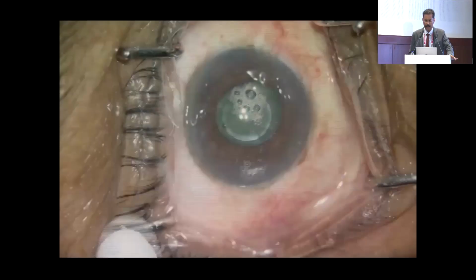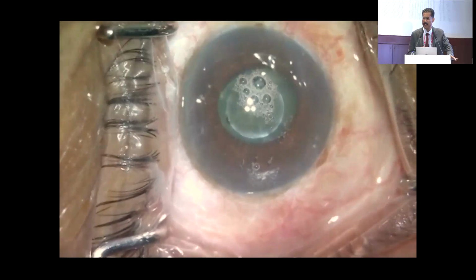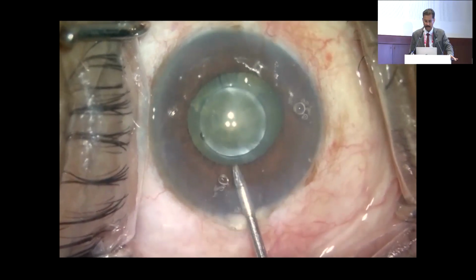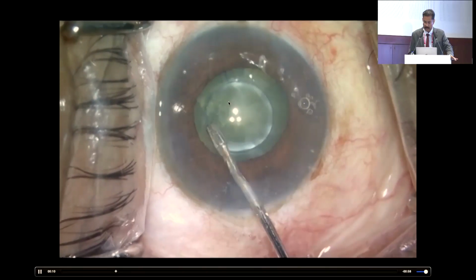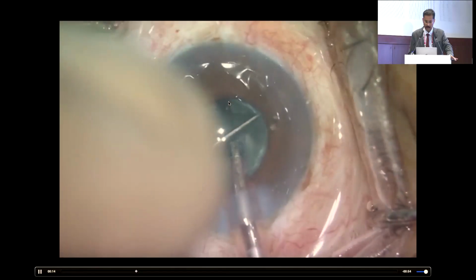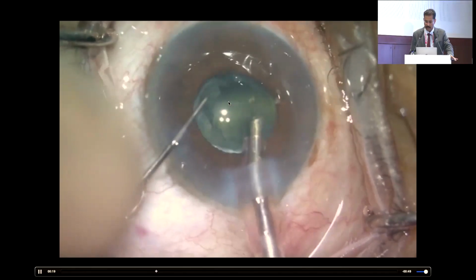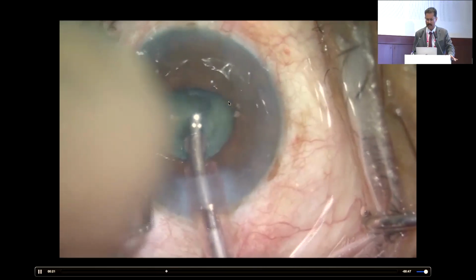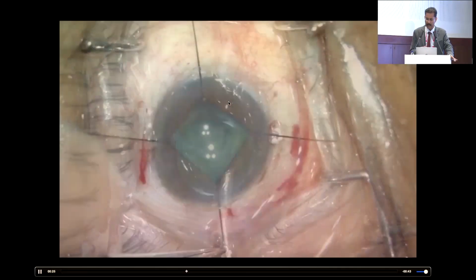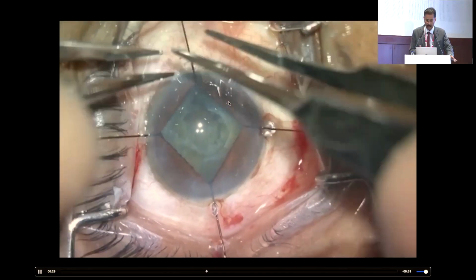In a small pupil, it's not worth doing if it is less than 3 millimeters. But if it is 4 millimeters, you can still do a capsulotomy. This is a 3.6 millimeter, which in some machines is the minimum you can do. And you can continue with phaco if it is a soft cataract, and the pupil becomes further small. It is actually more difficult to go on with a small rhexis. So ideally, I would put iris retractor hooks and enlarge the rhexis, which we have done, and then proceed.